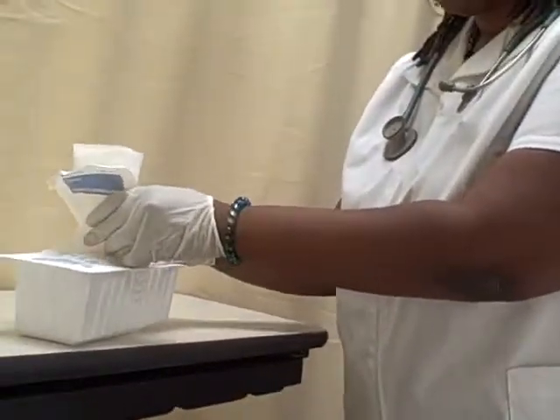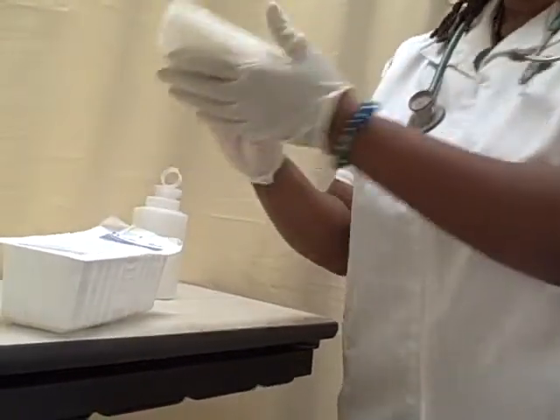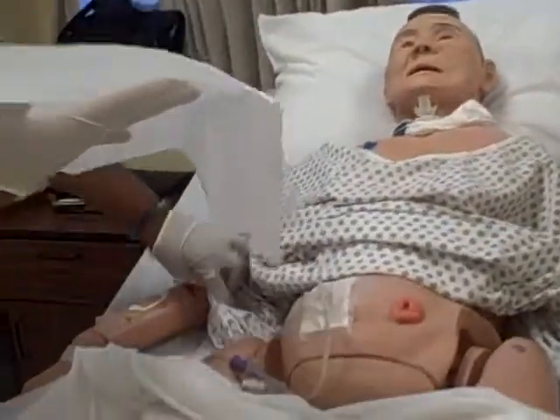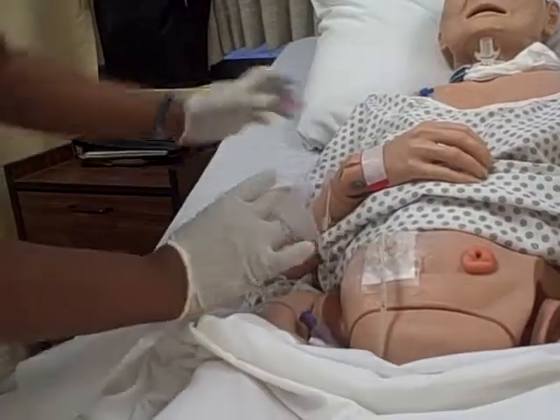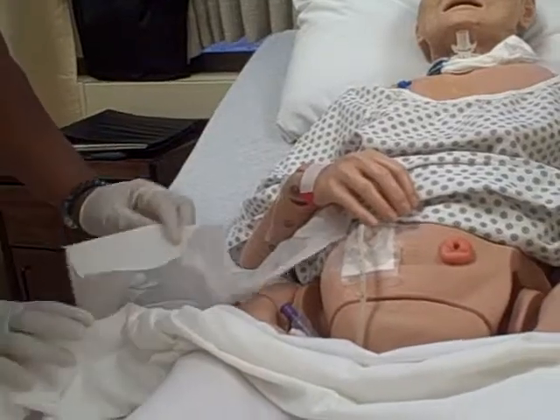I want to remove the container from the tray and remove the protective pad. Place it on the side of the patient, making sure not to get any gastric juices on the patient, on the bed, or myself.